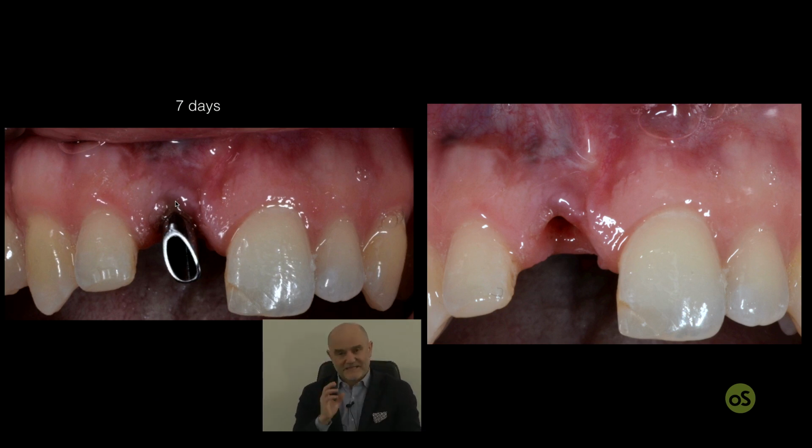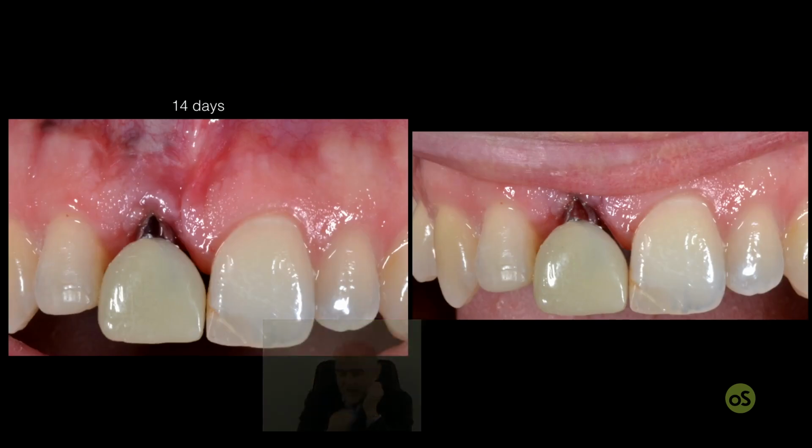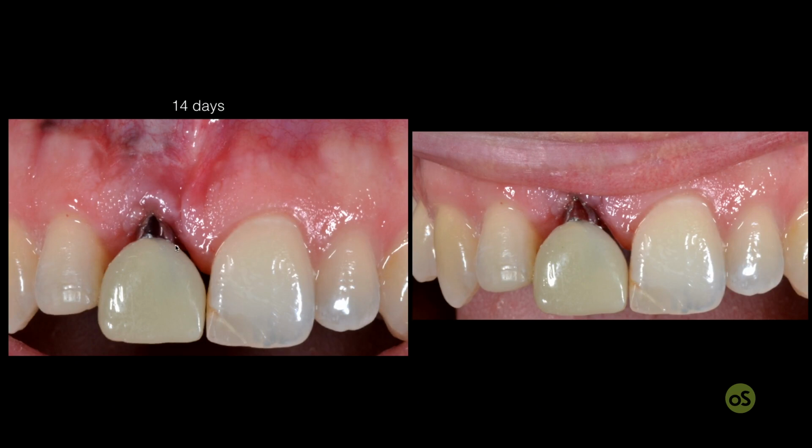So even if the patient asks us, can you please give me a temporary crown that masks this metallic exposure? You have to say, unfortunately, I cannot. You have to leave this temporary crown always short with respect to the soft tissue that is filling the interdental space, and also with respect to the keratinized tissue that is growing coronally. Otherwise, you will not see an improvement, because it's the temporary crown that will be an obstacle to the soft tissue increase. So there is no other way.